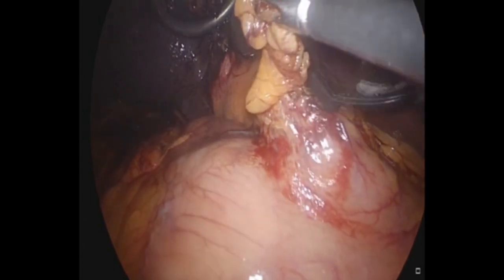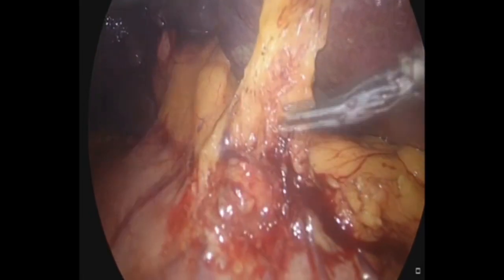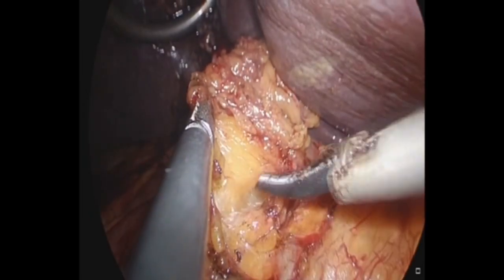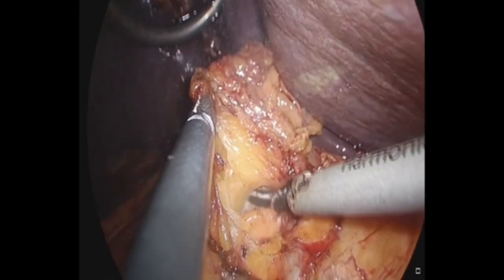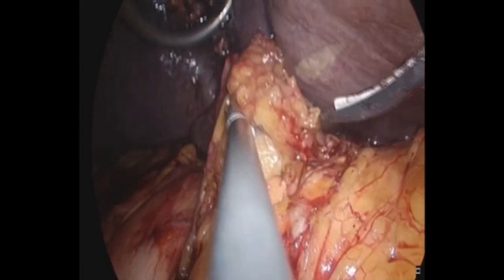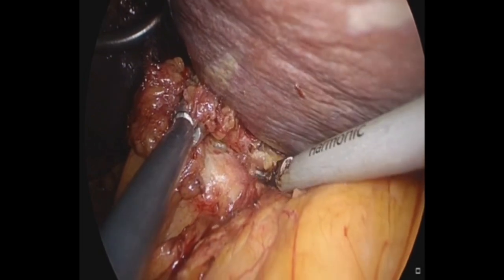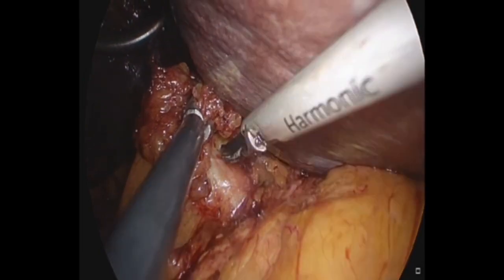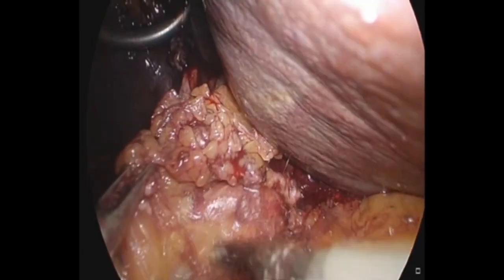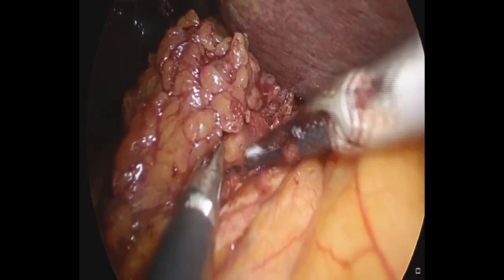The first step is taking care of all the fibro-fatty tissue in the hepatoduodenal ligament. The second step is wedge resection of the liver two centimeters all around the gallbladder fossa. In step one, we use the Harmonic 1000i HD.